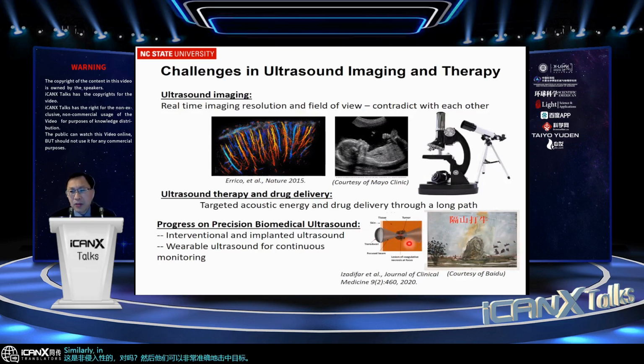Similarly, in therapeutic ultrasound, we want to do that. But we all know that with ongoing clinical therapeutic ultrasound, they can do something very similar to 隔山打牛, but there are some challenges. We still want to improve how we target better and deliver the drug in a more precise way.